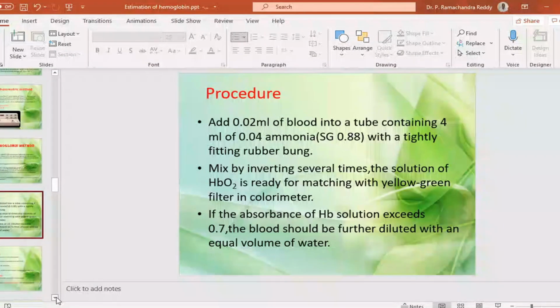I already gave you the exercise. You have to test your blood hemoglobin and kindly tell me the results on Monday. Download the WHO hemoglobin color strip, compare your blood color with that particular color, and then tell me the amount of hemoglobin present in your blood sample.